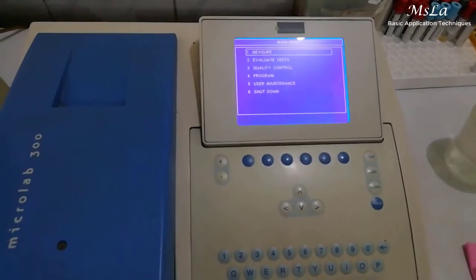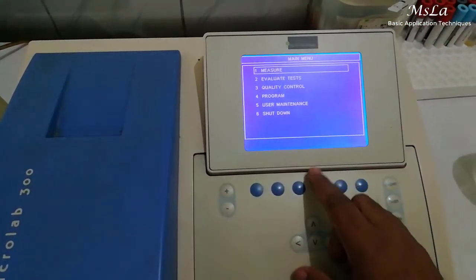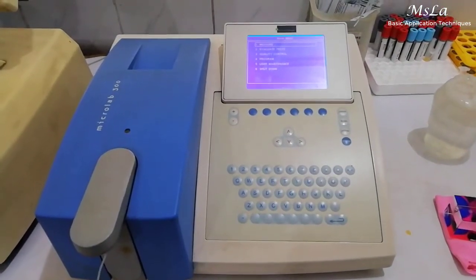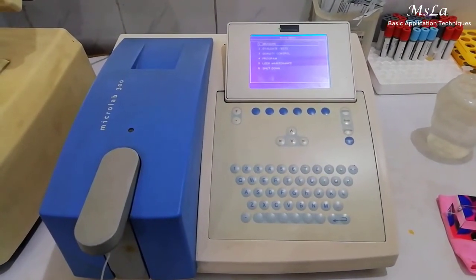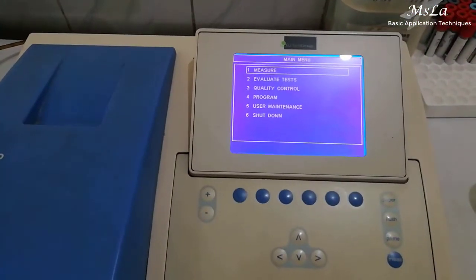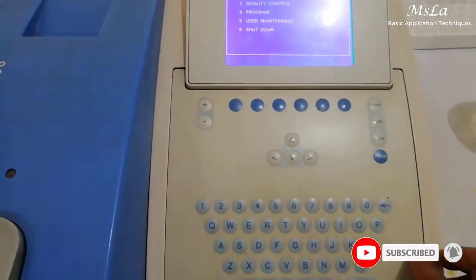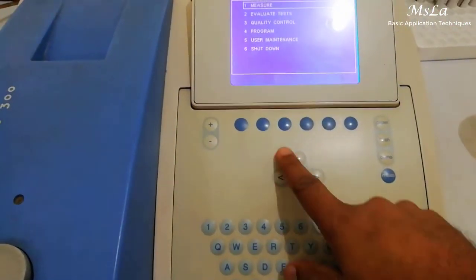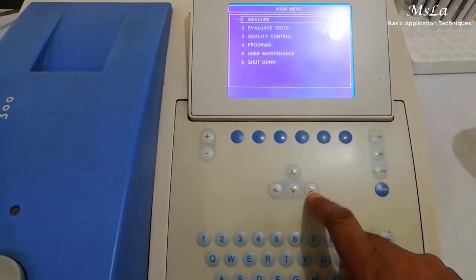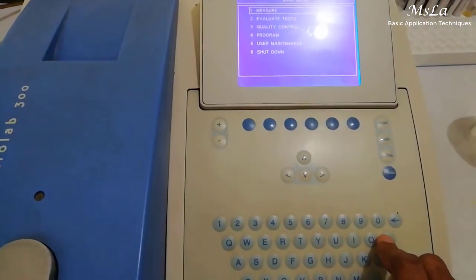By specification: Full Size Screen, High Contrast Graphical LCD Display, Quadri Keyboard, Easy to Train, Operate and Maintain. 63 Programmable Tests. 12 Position Filter Wheel, 6 Position Filter installed — for example 340, 405, 505, 578, 620 — with 6 Position Core Optional Filter.